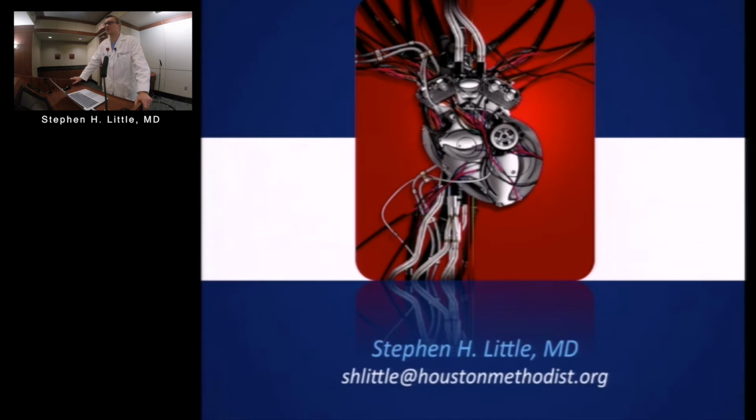As I said, I was in Dallas last week, and they have not only a sonographer present in the room, but they have a sonographer who actually acquires the vast majority of the images. Their sonographers are manipulating the probe in the OR, I guess under the direction of the anesthesiologist technically. The sonographer is there first. The probe is put in by the anesthesiologist. The sonographer is capturing the vast majority of the screening TE, so all the basic shots to begin with that take 10 minutes at the beginning of a case. And then the cardiologist comes in, quickly reviews those images, and is there for the action part of the case. I'm not sure what the details are in the regulations, but some centers do it like that.